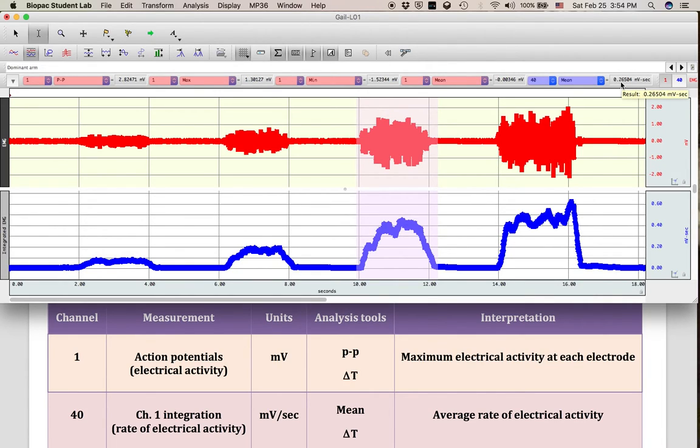I have 0.265 millivolts occurring every second within this clench effort on average because it's taking the beginning, the middle, and the end of the clench effort. What is the average rate in that clench effort? That is what channel 40 mean really tells you.